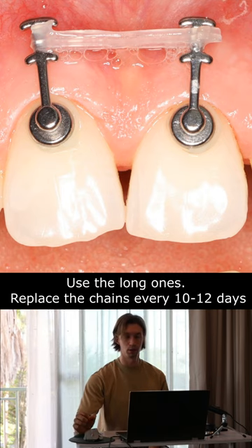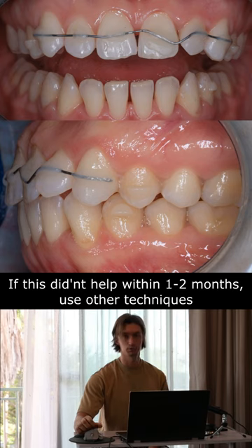Replace the chains every 10 to 12 days. If that doesn't help, you should use other techniques like wires and brackets.